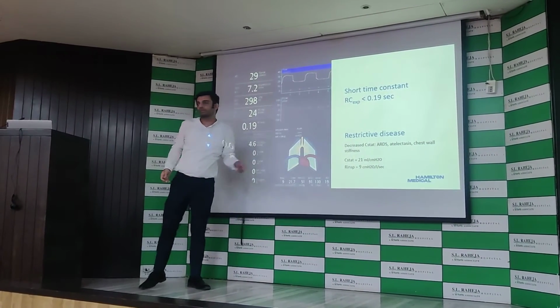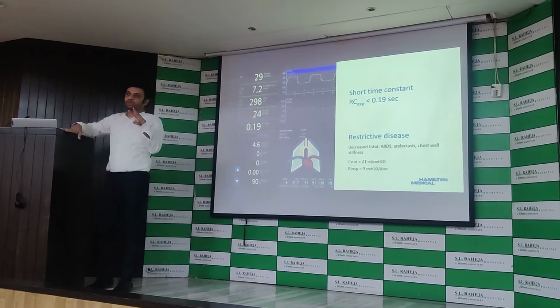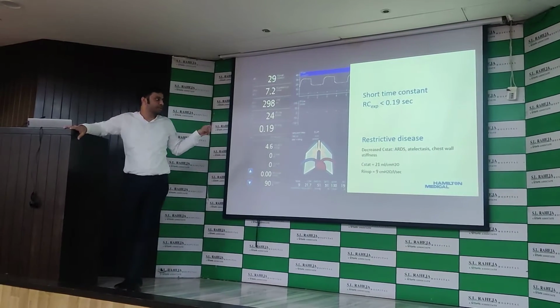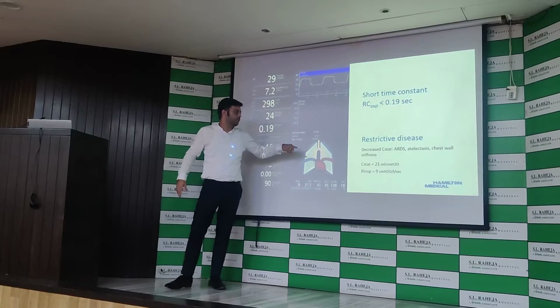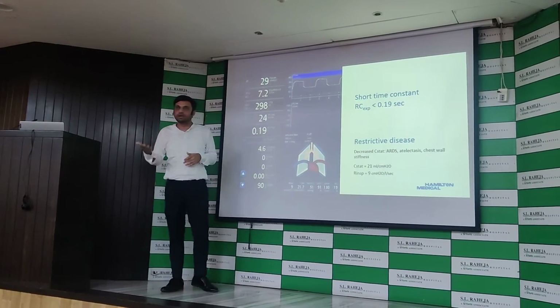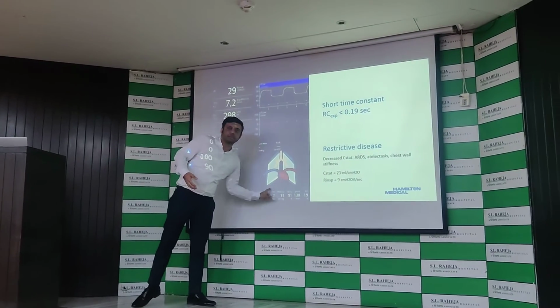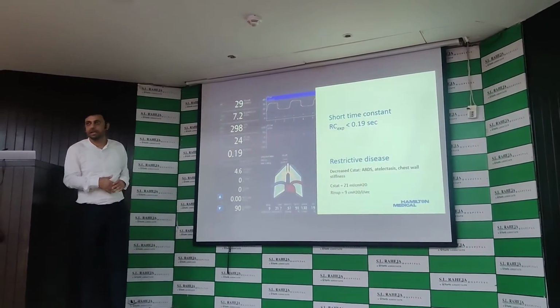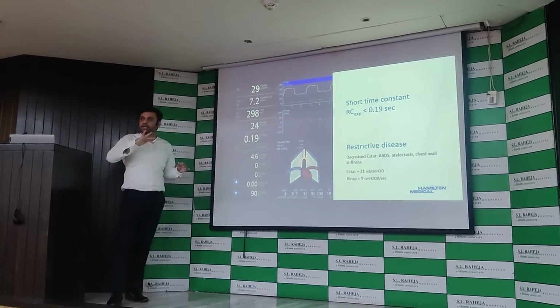In that case, it is showing a restrictive disease. So it is showing in terms of visual monitoring the inspiratory resistance in your airways, the compliance in the lungs, and for the patient's inspiratory effort or trigger, you'll see a small diaphragm coming in and going. In case it doesn't trigger, it will not come.